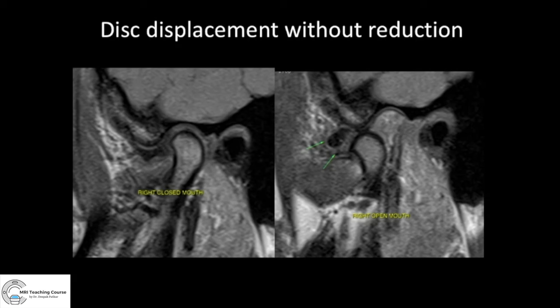Next, look for changes of osteoarthrosis in the mandibular condyle — once you have assessed the disc position. Look at non-fat-sat PD images for small erosions, subarticular cystic changes, subarticular sclerosis, and osteophytes — all of these suggest osteoarthrosis. Here, this patient had bilateral severe temporomandibular joint disease — you can see significant sclerosis and erosions along the temporal bone. Somebody who has had chronic dysfunction will develop osteoarthrosis.